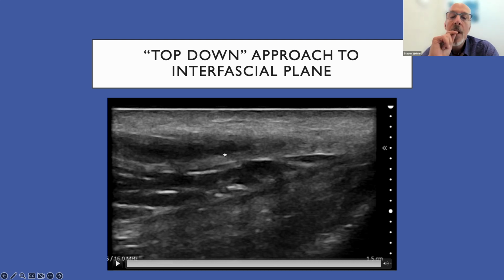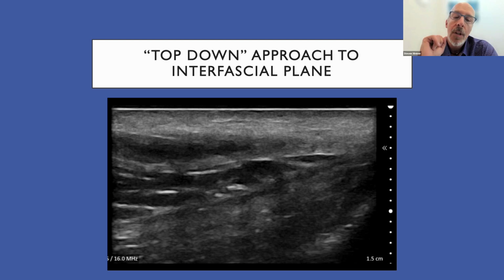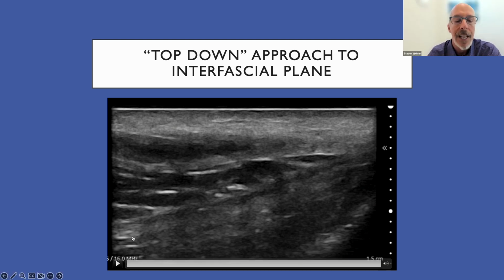interfascial plane. Now, a little trick that I do is often I'll inject a little saline before I inject the filler. And by injecting saline, if you're not in the correct plane, it's not a big deal. But it also expands that interfascial plane because sometimes the two fascias are very close together and very hard to separate. So the saline actually separates that out.